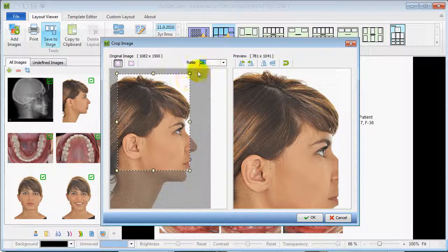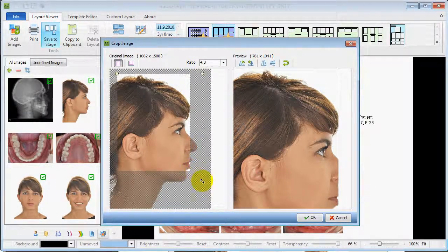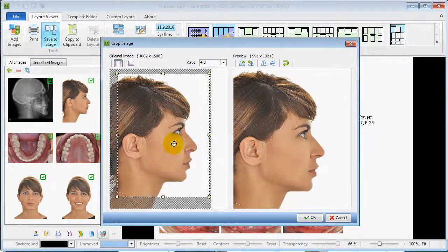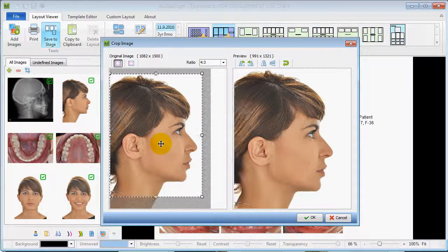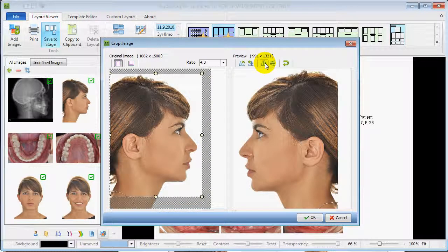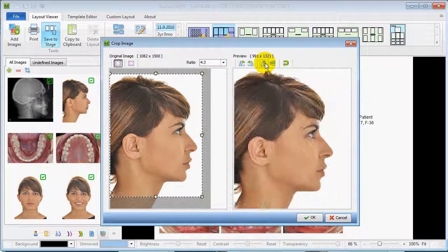You can also select different ratios — we'll be using 4 to 3. On the right side you can see the preview of the crop, which you can flip and rotate.